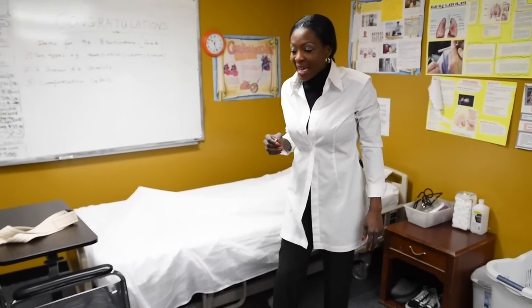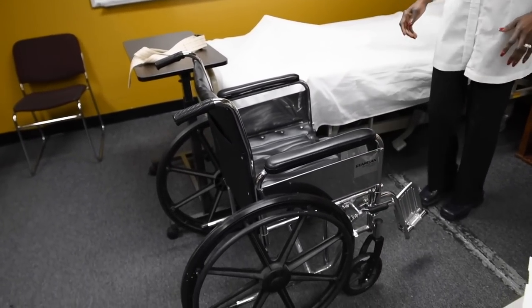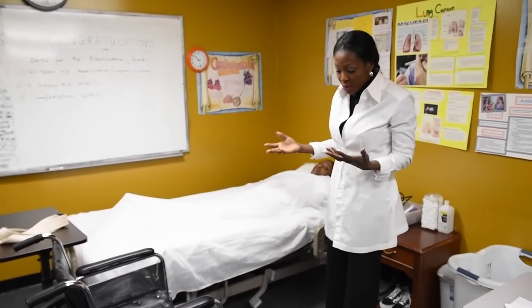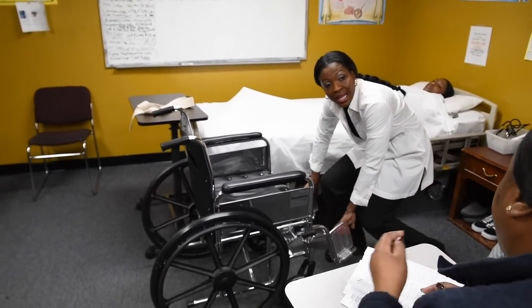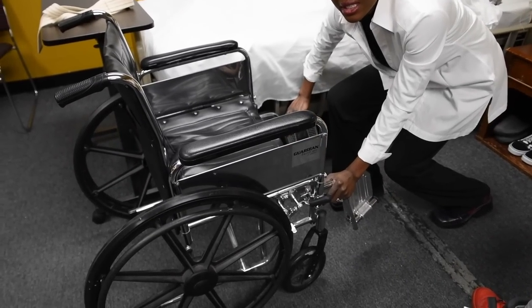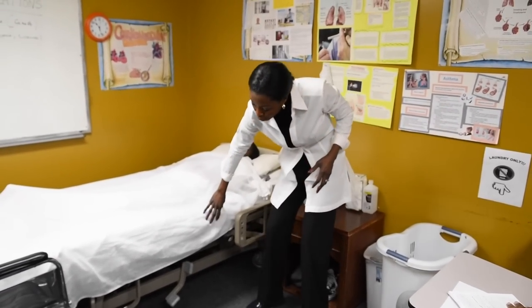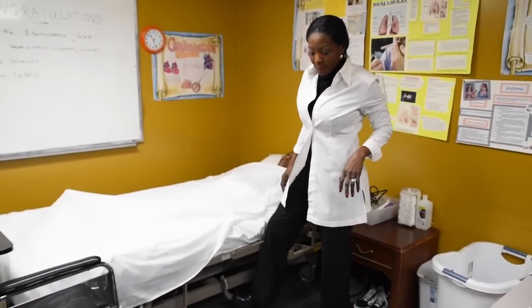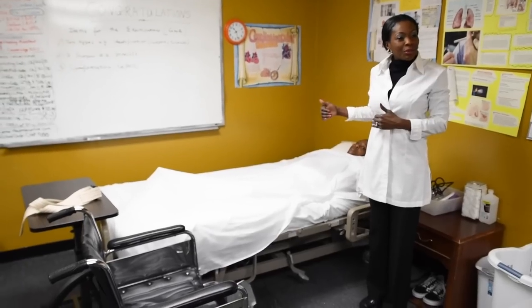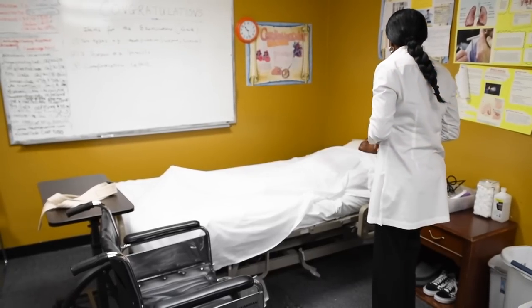One of the critical elements says before the patient gets in the wheelchair, you need to lock the wheels of the wheelchair, all right? The examiner is watching me, they're not speaking to me. Another thing that we need to do when we are using a wheelchair is to fold the footrest. So if the footrest is not folded, okay, you are responsible for what? Folding it, okay? The next thing we will do, which is part of the critical element, is for you to tell the examiner you would lock the wheels of the bed, all right? Everything that I'm doing is part of the what? Steps. That's how we got to 15 or 14 steps for this particular skill.